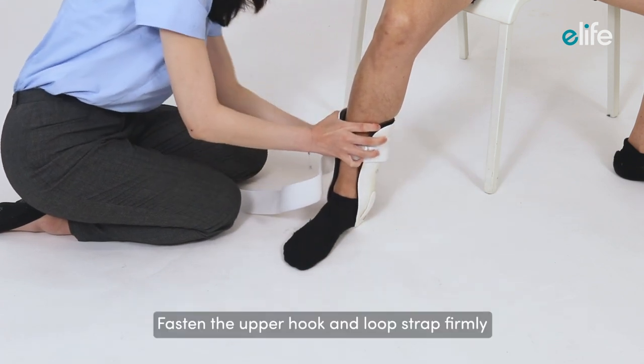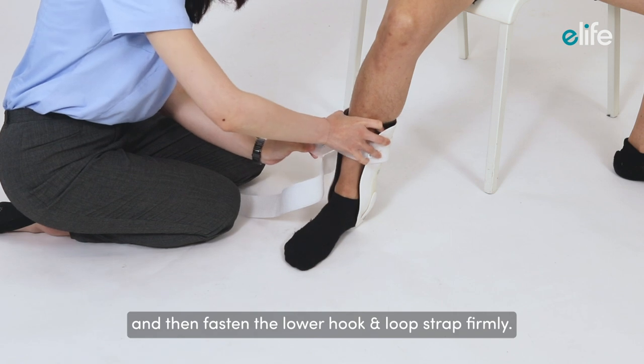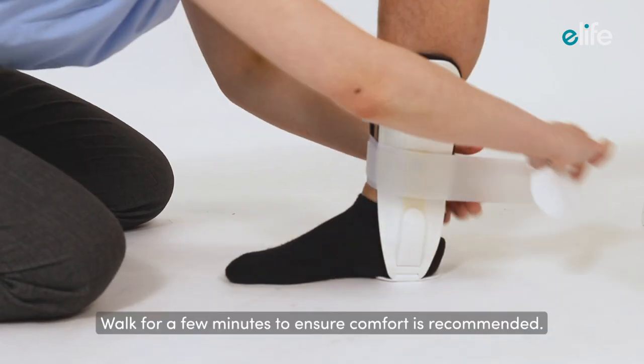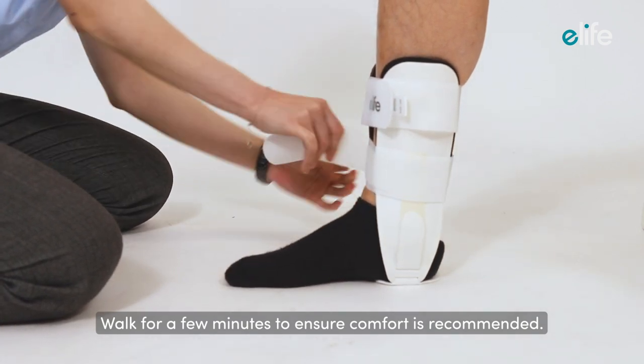Fasten the upper hook and loop strap firmly, and then fasten the lower hook and loop strap firmly. Walking for a few minutes to ensure comfort is recommended.